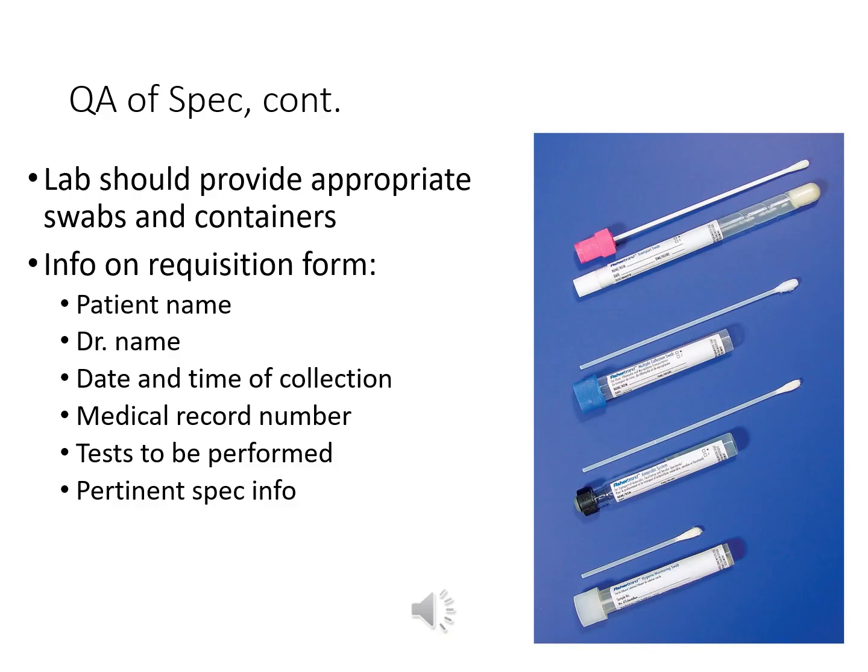Generally, it's the lab that provides the appropriate swabs and containers to the testing or the collection personnel. We do need to make sure that we pay particular attention to the swabs. They could be cotton, they could be Dacron, they could be a different type of material. So we just kind of need to make sure that it's the appropriate one. Depending on whether you're swabbing for bacteriological studies or virology, the material of the swab will impact the recovery of the organism. You need to have part of your standard operating procedure to specifically include what type of swab it is and if it's aerobic or if it's an anaerobic culture.